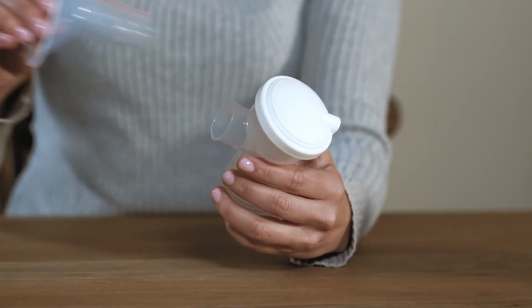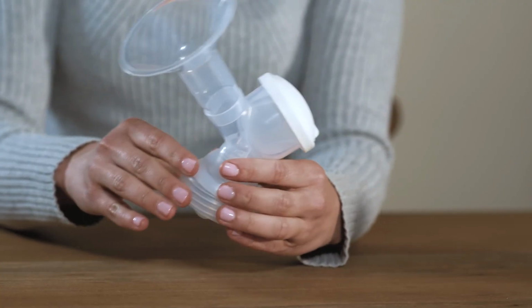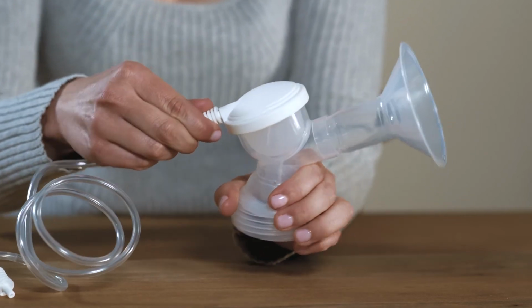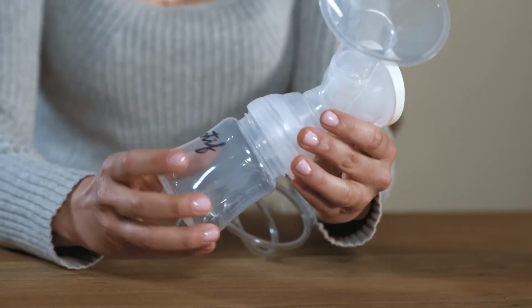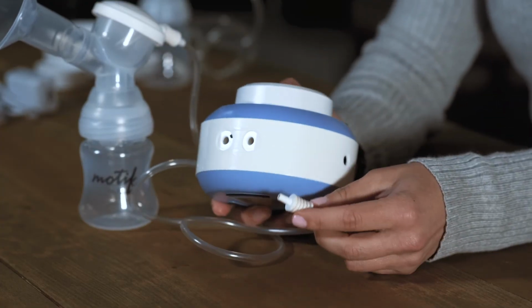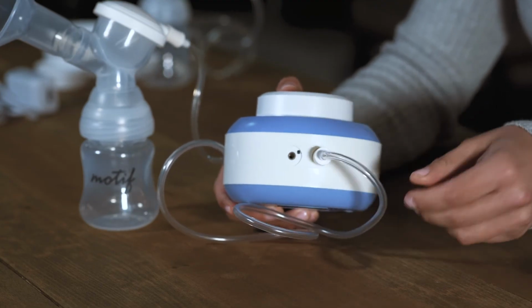Next, place the appropriately sized breast shield into the breast shield connector. Insert the tubing connector with the tubing attached into the diaphragm and screw the storage container onto the connector. Then, insert the tubing connector into the tubing port on the breast pump.